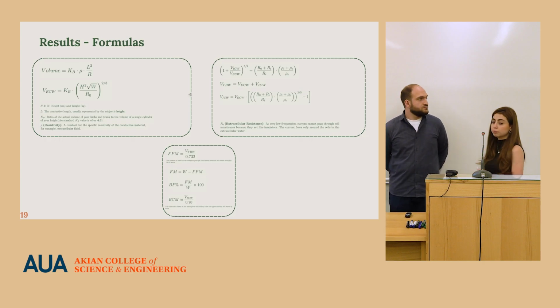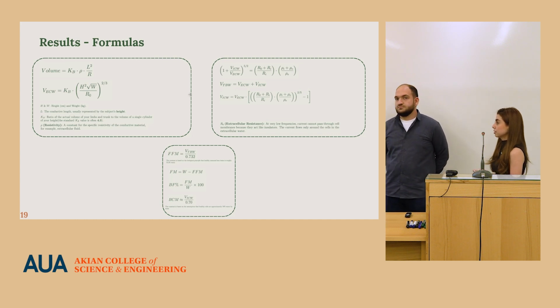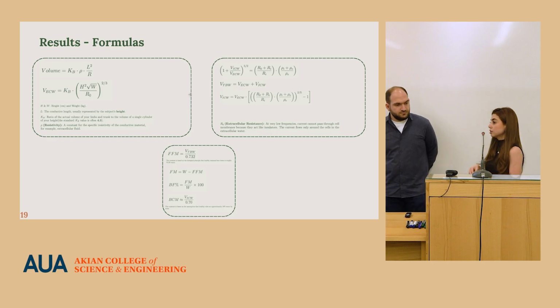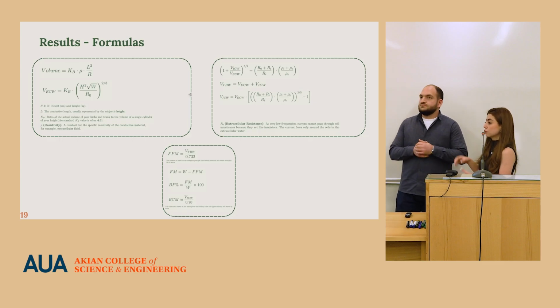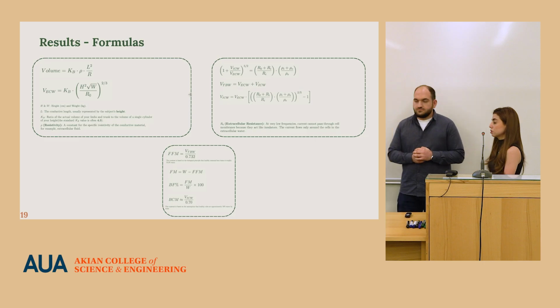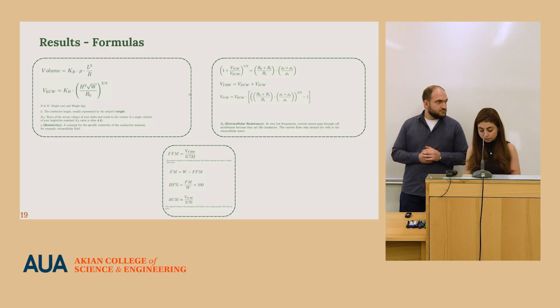And the most important part of this is the volume formula, which has the KB constant, as you can see. This constant is crucial because it treats our body not as a uniform cylinder, but as a combination of 4 cylinders. And for adults, there is a general constant for that of 4.3. So we just plug in those values and the personal reactance, resistance, or other body parameters and get our results.